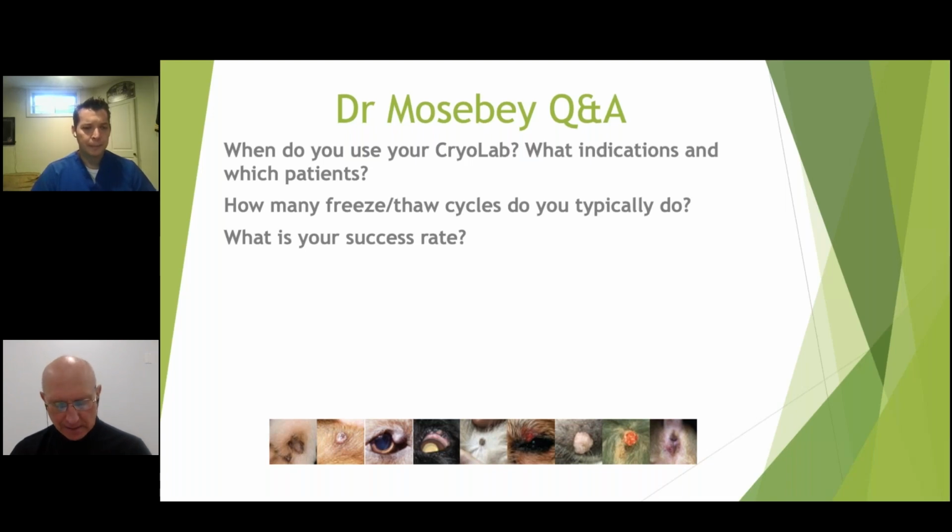Right. So again, your point is well taken, and I think clinicians should be realistic about expectations, but the more aggressive they are, the more likely they're going to take down whatever that lesion is to the margin with greater success. Definitely. Like I said, if you can get, let's say, 3 30-second freeze cycles on almost anything, if you're getting it fully frozen for its size, you're probably going to have 90% success on those first time treatments.